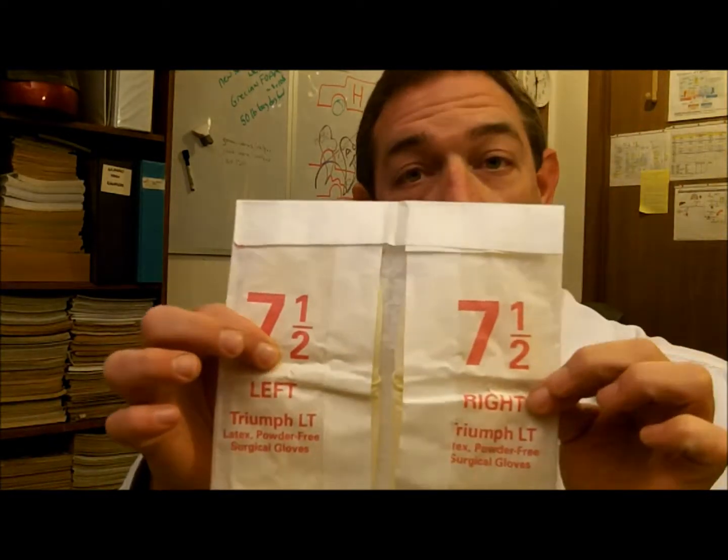They actually come left and right, so they're pretty sharp. We're going to use the 4-0 silk. Get that out of there, and it comes like that. Open that up — you see the little suture at the end. This is going to be good to work with.